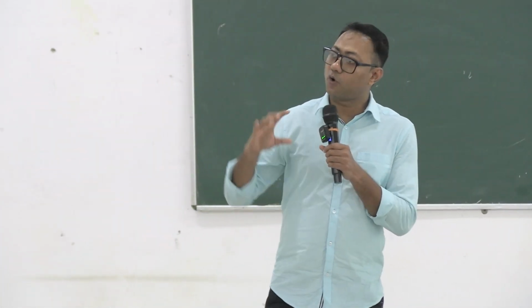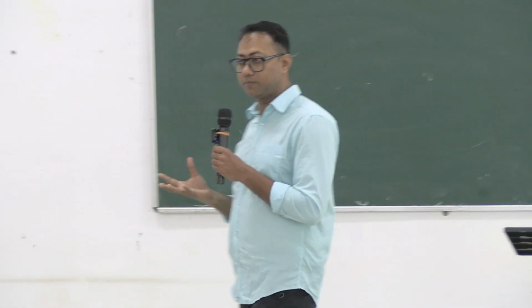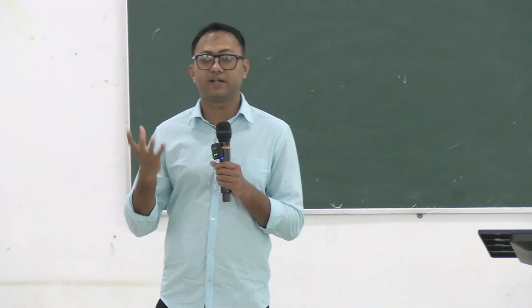Okay, and an ECG recording is the sum of all action potentials happening within the heart, right? This PQRST complex is not a single action potential, it is the sum of all action potentials happening in the heart, right? So we have a few copper wires and some voltmeters, and with the help of these we will construct an ECG machine. As simple as that, an ECG machine is simply a collection of voltmeters which measures potential difference between 2 points, right?